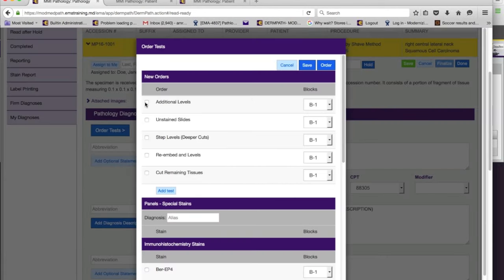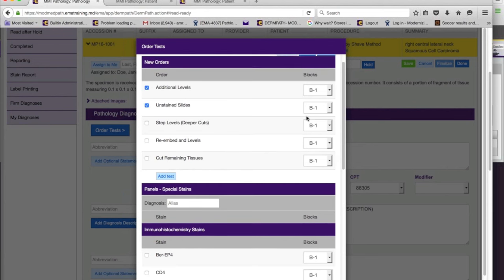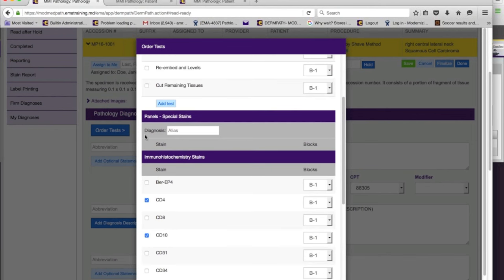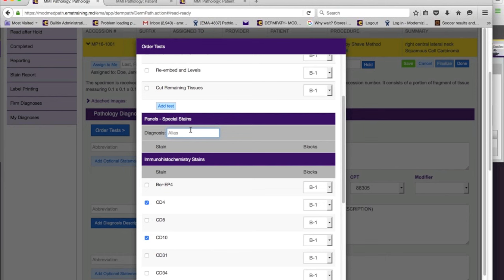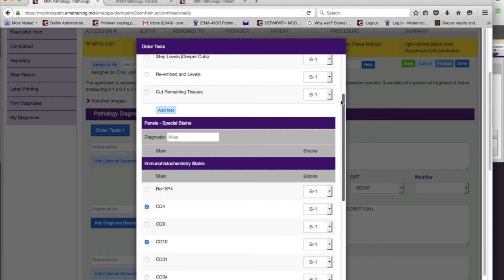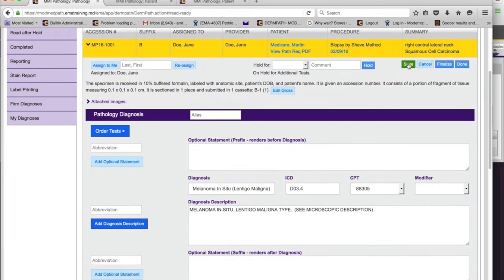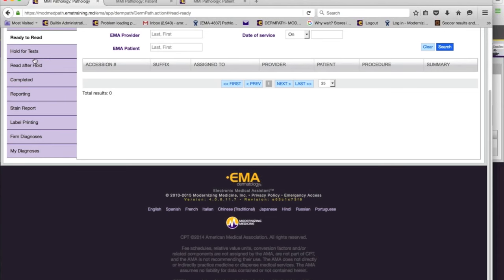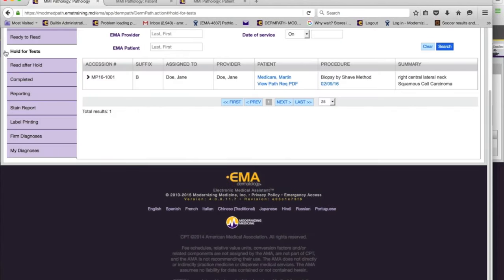If you want to order immunohistochemistry stains, click 'order tests.' You get options such as additional levels, pick the cassette — in this case only B1 — and order stains from there. There's also a shortcut in setup where you can create panels of tests: if you suspect a certain diagnosis and typically order the same tests, you can set them up driven by the same alias to save time. When you finalize your tests, say 'order' and 'save.' The cases move on — the one with additional stains goes back to the lab.